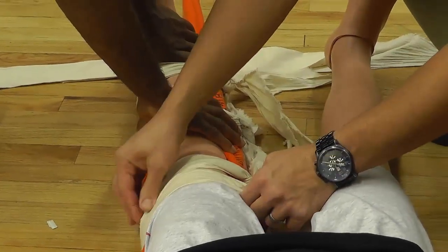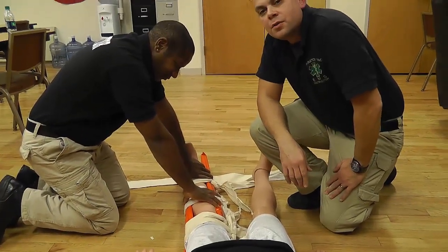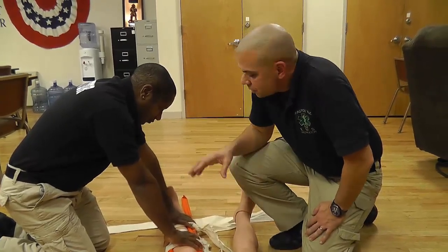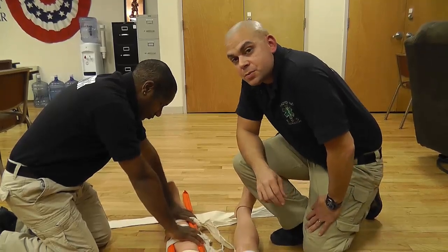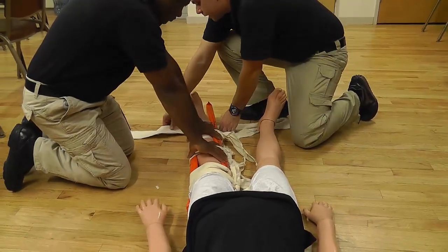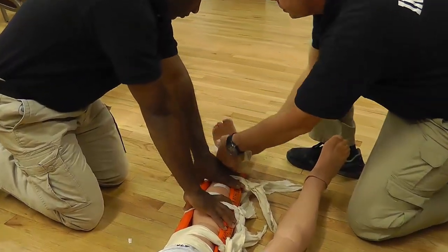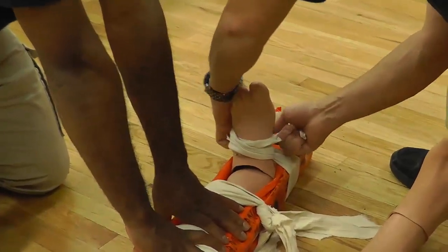Now, remember the goal here is to immobilize the joint above and below the fracture site. In this case, the two joints we're concerned about are the knee and the ankle. In order to accomplish immobilizing the ankle, I'm going to use an ankle hitch, which is my fifth cravat. I'm going to take my cravat and move it around under the patient's foot, go over the patient's foot, and come back down below the patient's foot.